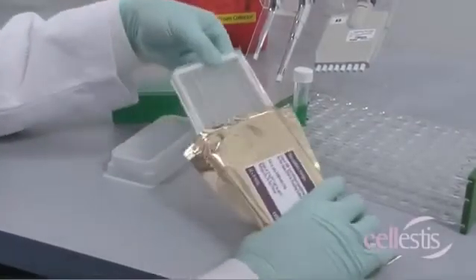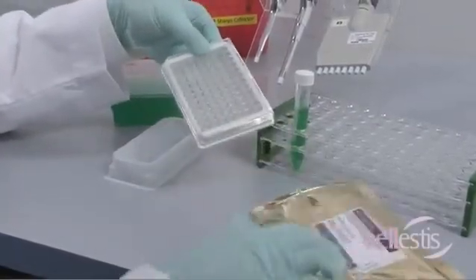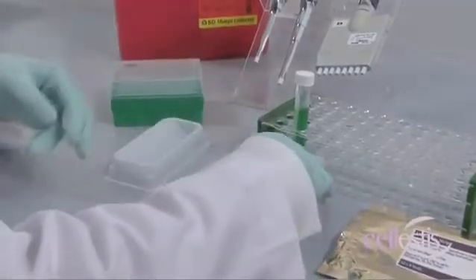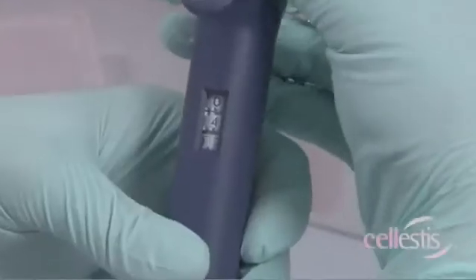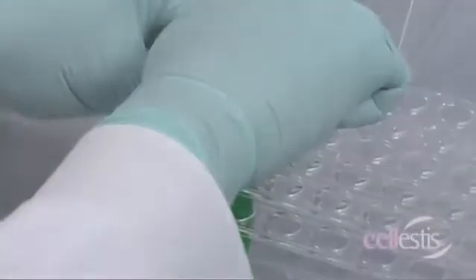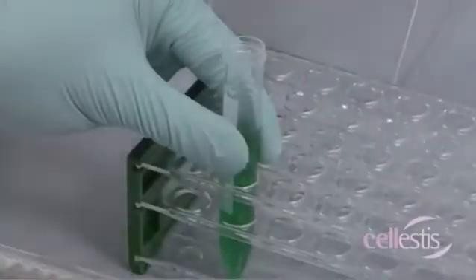In the QFT ELISA, the working strength conjugate is the first reagent added. Add 50 microliters of freshly prepared working strength conjugate to the strips being used.